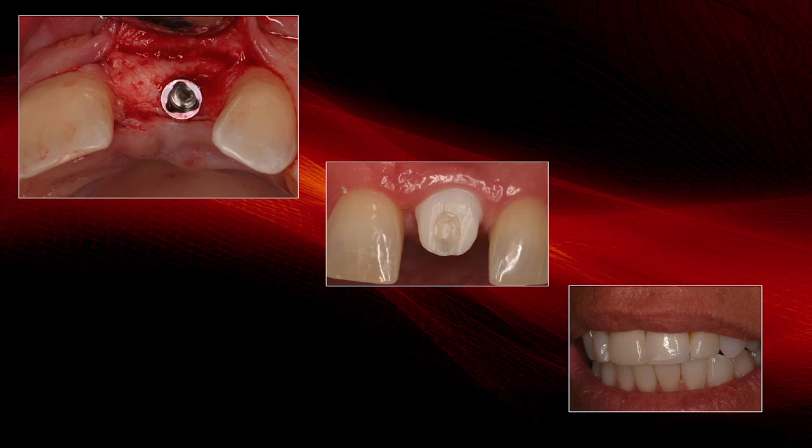Since we have good primary stability, because we achieve this in anterior bone, which is generally type 2 bone between premolar and premolar, we place a healing abutment, and after sufficient time, generally 3 to 4 months, we can remove that and take an implant level transfer. The laboratory will create a custom ceramic zirconia abutment and a ceramic zirconia crown, optimizing the aesthetics, and you've optimized the soft tissue. And again, you can see the soft tissue is in harmony with the adjacent teeth.